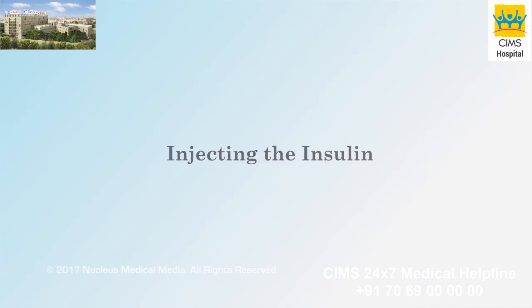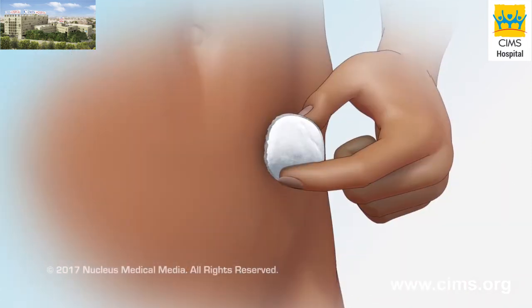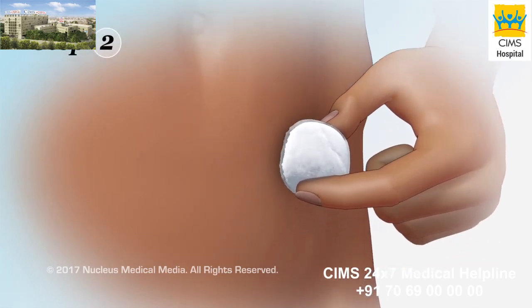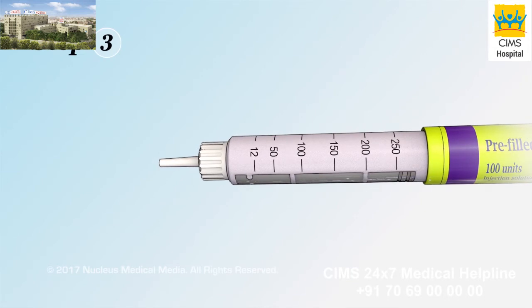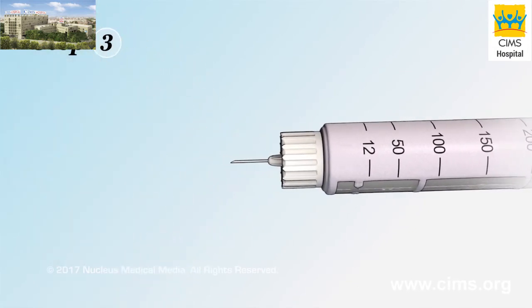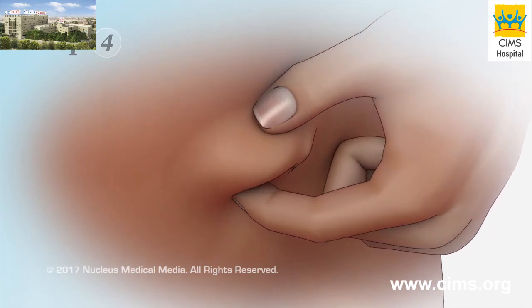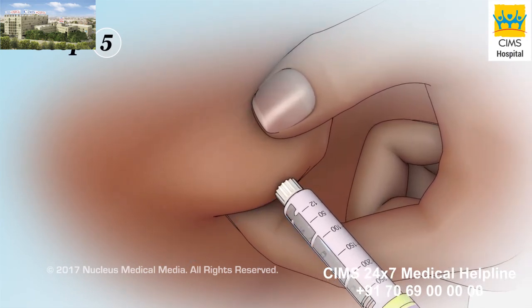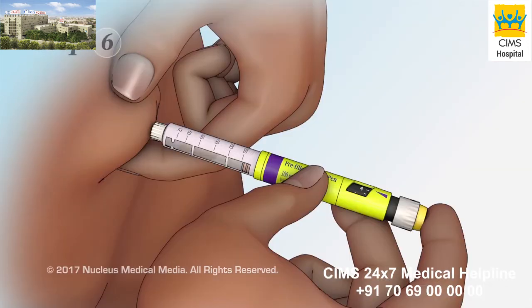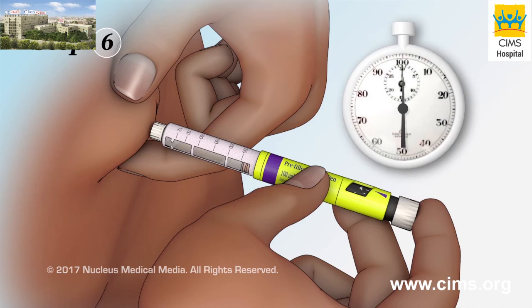Injecting the insulin. Step 1: Turn the dosage dial to the number of insulin units you need to inject. Step 2: Clean your injection site with an alcohol wipe, using a circular motion to clean a spot about 2 inches wide. Step 3: If you replaced your pen's inner needle cap, remove it now. Step 4: Pinch a 2-inch fold of skin in the cleaned injection spot. Step 5: Quickly insert the pen's needle straight into your skin at a 90-degree angle, making sure the whole needle enters your skin. Step 6: Push the pen's injection button all the way down to inject the insulin into the fat tissue beneath your skin. Slowly count to 10 before removing the needle to make sure you injected all of the insulin.